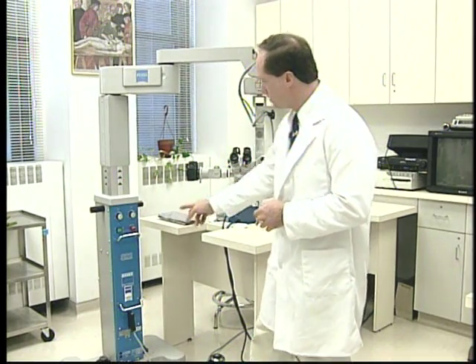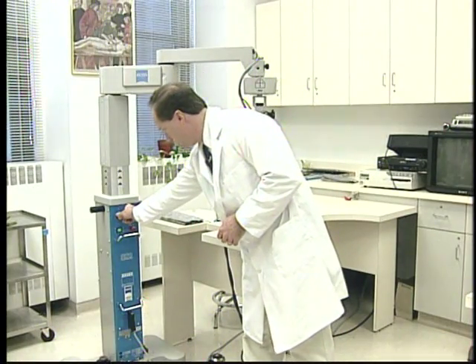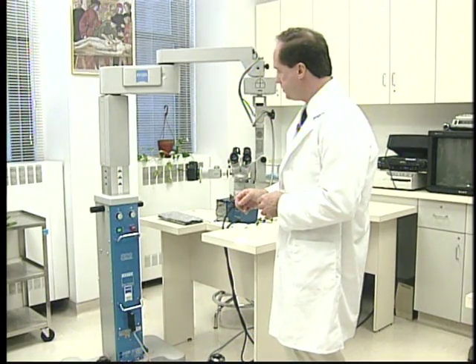Now, assuming the microscope is correctly plugged in, there's usually a separate power button to press, and then there are other controls to turn the light on for the microscope, and usually we'll turn these up to the maximum. There may be 2, 3, or even more knobs for this purpose.